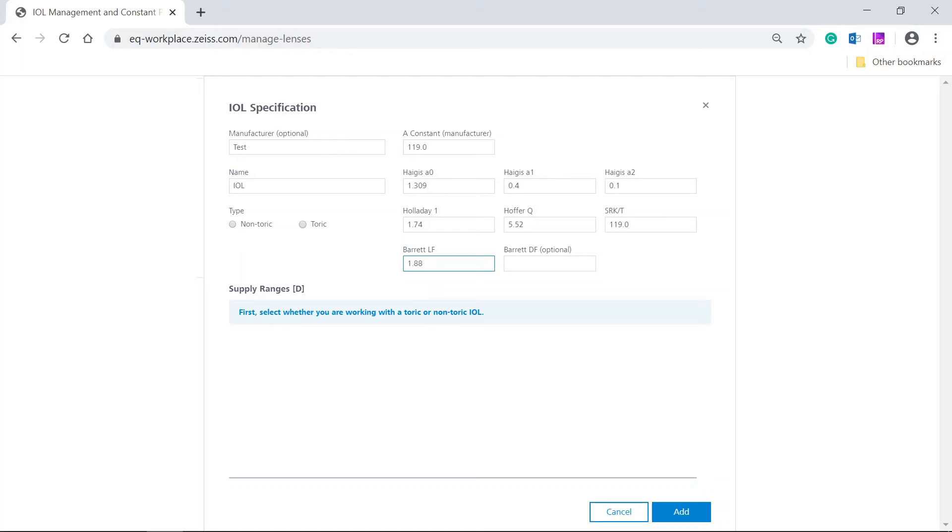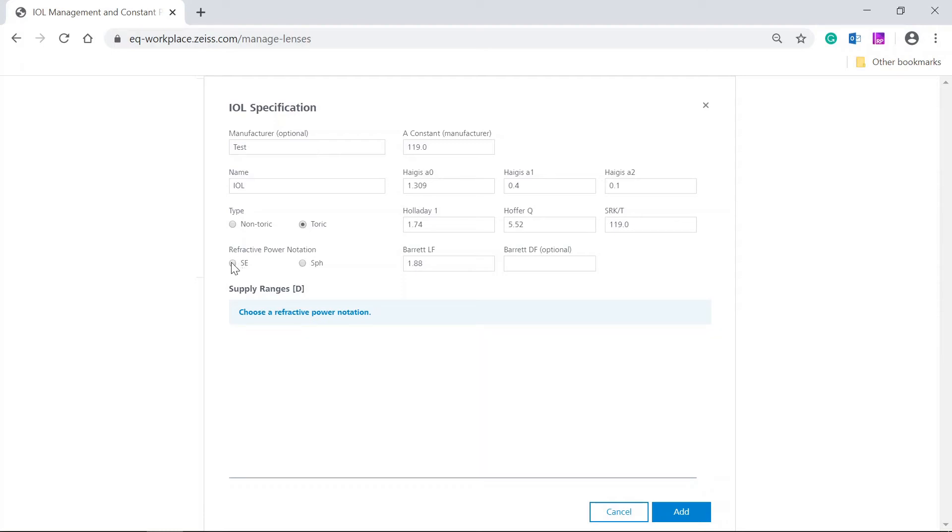Select the type of the IOL. As we are about to add a TORIC IOL, we select TORIC. Choose if the IOL is delivered with spherical equivalent steps, SE, or with spherical steps, SPHERE.